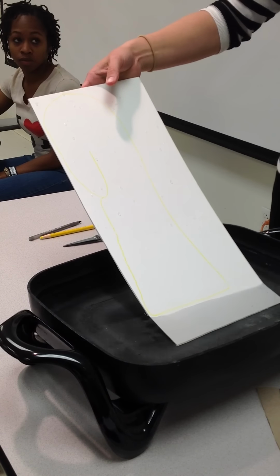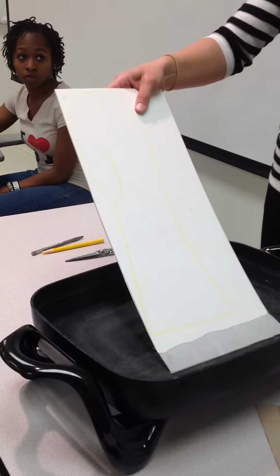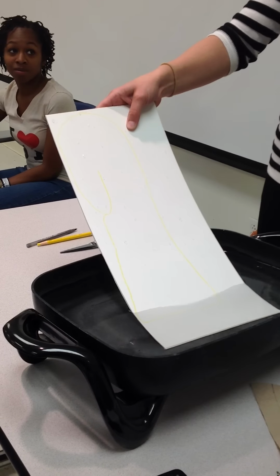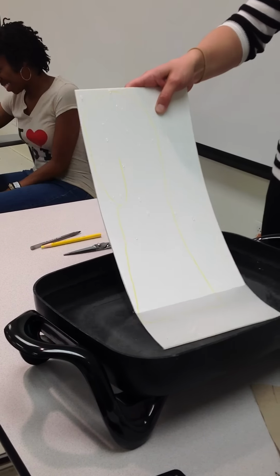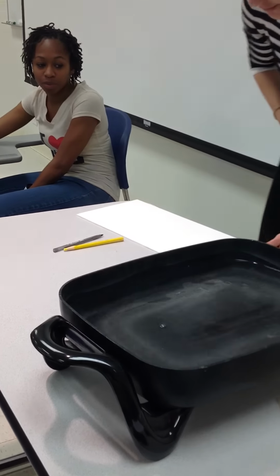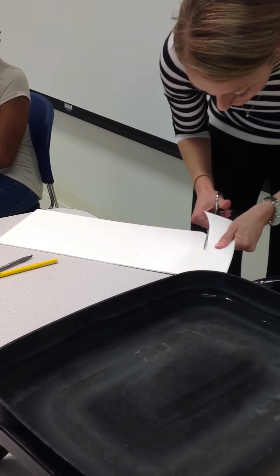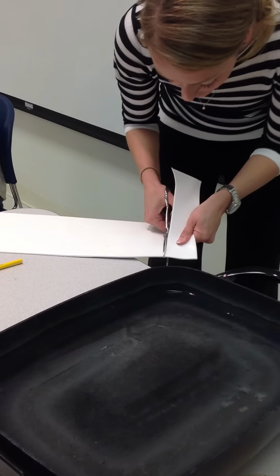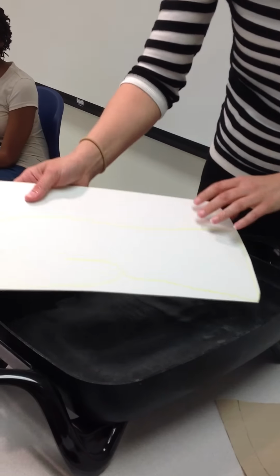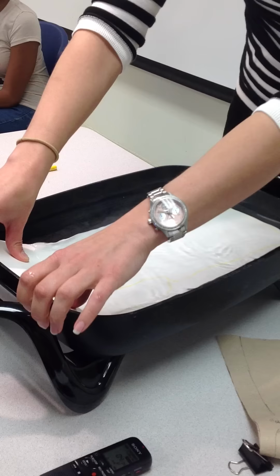So with this material, you have a lot of time, so don't freak out and try to get in a big hurry, because you need it to cool off just a little bit before putting it on your patient. You can relax. Soft enough. So I'm just going to go ahead and cut. And then it should all fit in there. As it softens, it's going to go.